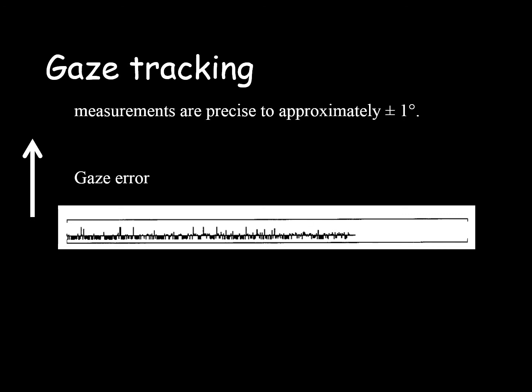Again, next is the gaze tracker. It is found at the bottom of the printout. We have a reflection line. This is the test over the time. We have reflections up and reflections down. Reflections up mean that there was a gaze error. Reflection down means that the software could not detect the gaze.